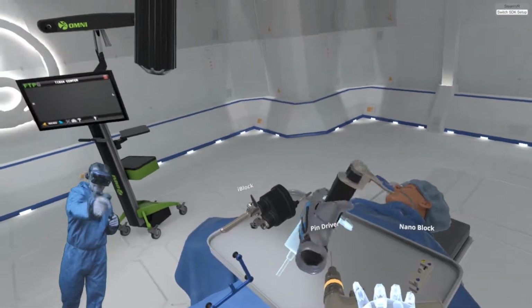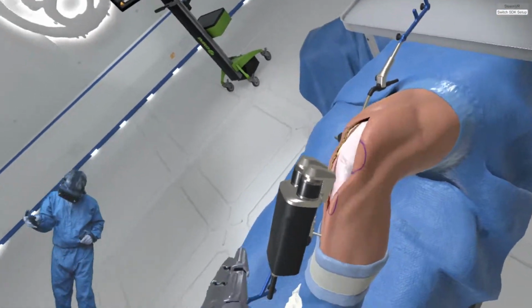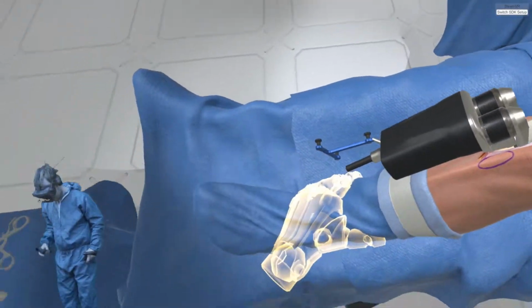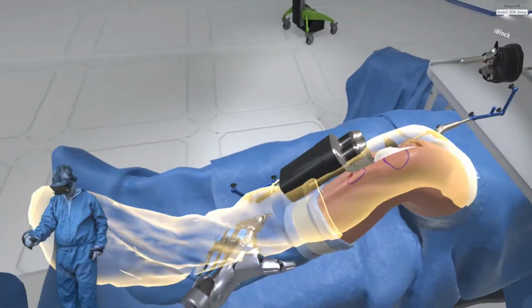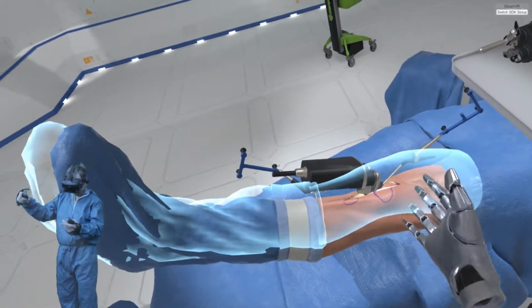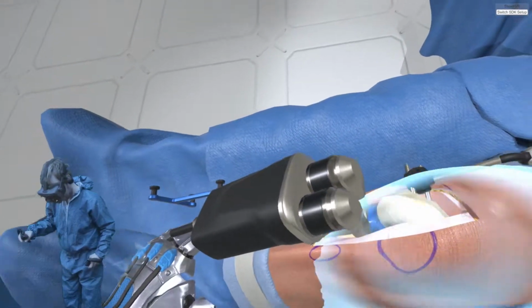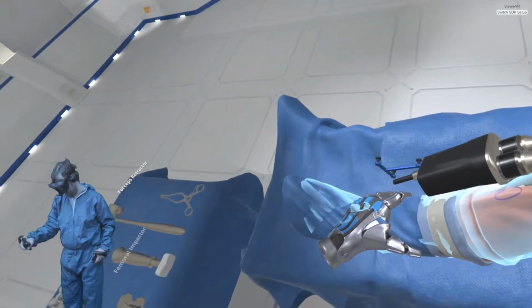Install by inserting the robotic paddles into the joint space on the resected tibia. Grasp the ankle and manipulate the leg into full extension and back, maneuvering the leg through a complete range of motion to get quantitative data on the knee. When complete data acquisition is achieved, return the knee to 90 degrees of flexion.